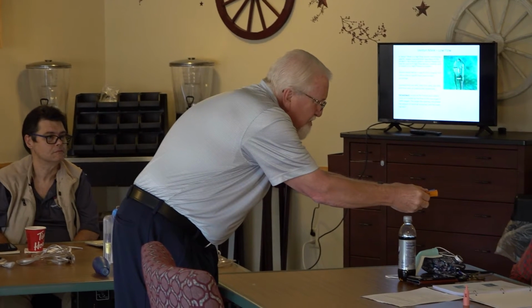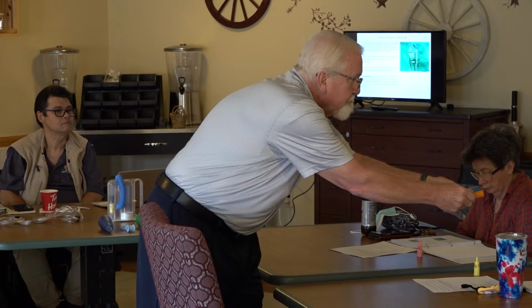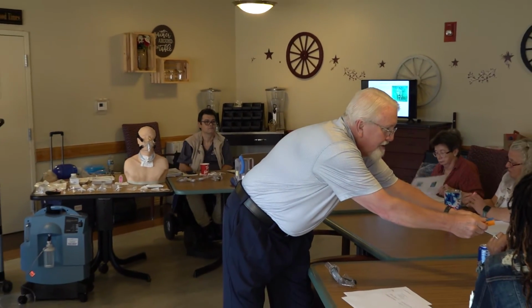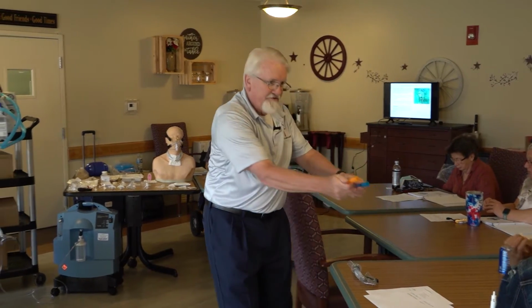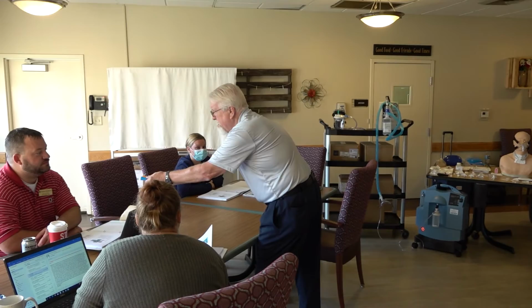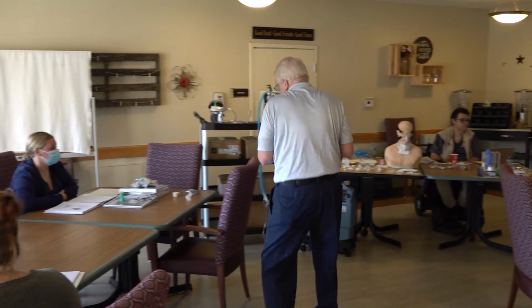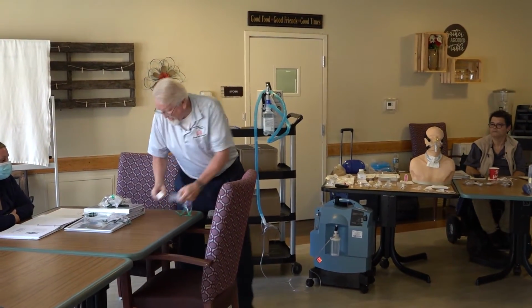Look at the difference in the holes. So I'm getting a whole lot more oxygen with this one, and I'm entraining less with that one. See the difference? I'm getting more oxygen with that one. All right. Let's see. Everybody understand that principle?